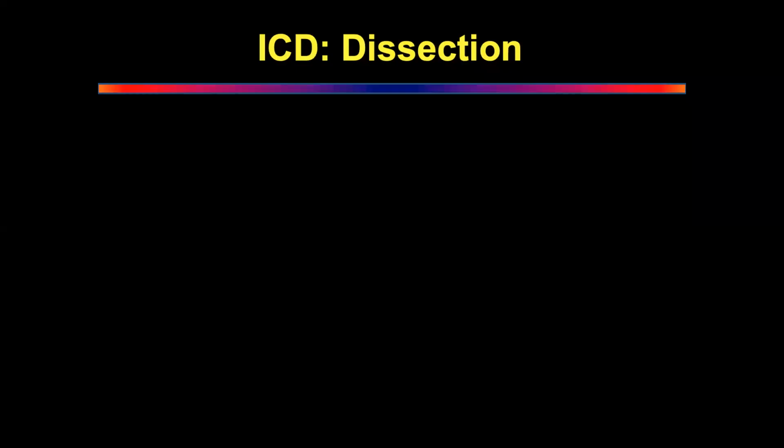Now tell me, in literature, what organs have been injured because of an obturator? Just one by one, name them. Lungs, heart, intercostal vessels, left ventricle, liver, spleen, all the organs. Diaphragm, stomach. Okay, every single organ, esophagus. So every single organ that is there has been reported injured by the obturator.